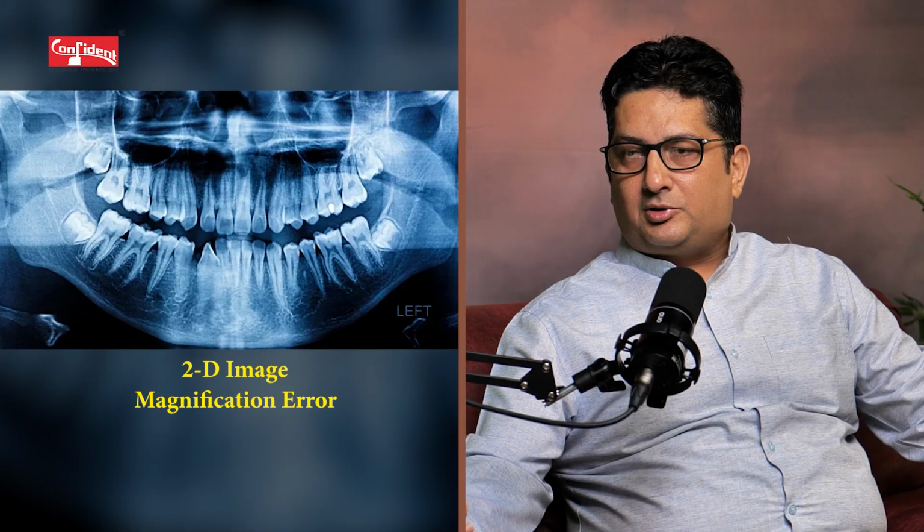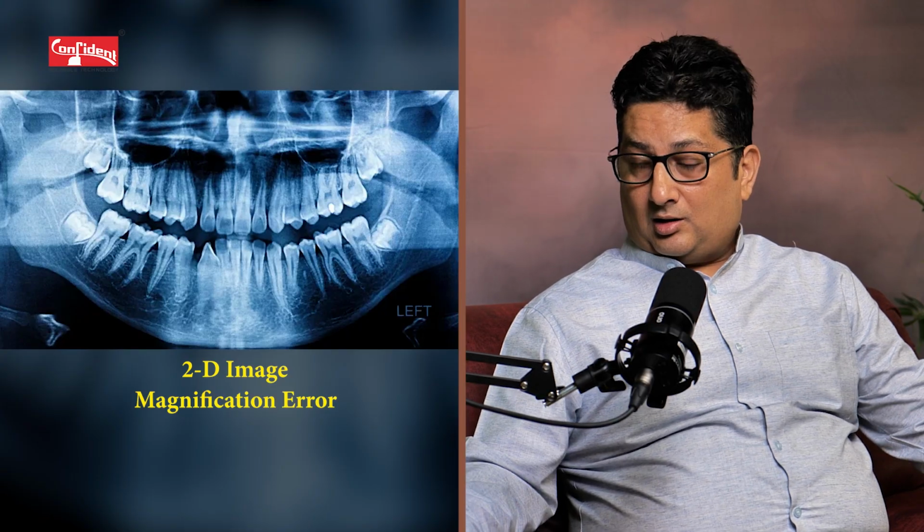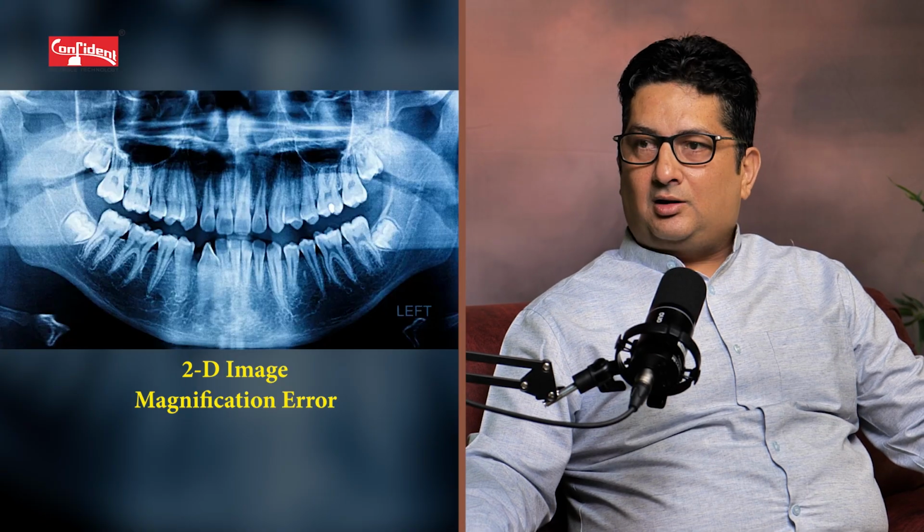Thank you very much, sir. So you mean to say that orthopantomogram is a 2D image, whereas CBCT is a 3D image, and in CBCT there are no overlaps and there are different layers which you can peel and see the depth, which is missing in OPG, and also OPG tends to have magnification. Yes. If it says 108% or 113%, the actual image is magnified, so you can't take it as it is. So we have to apply the error coefficient, which is missing in CBCT.